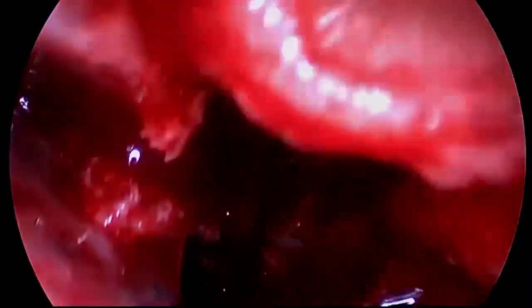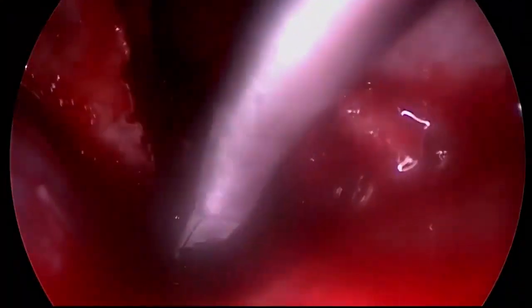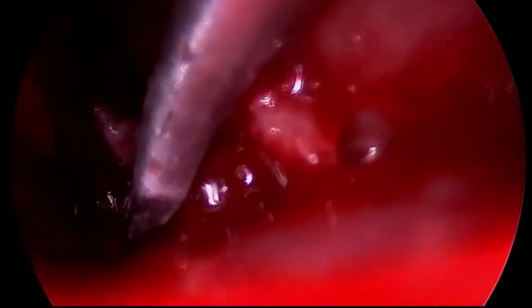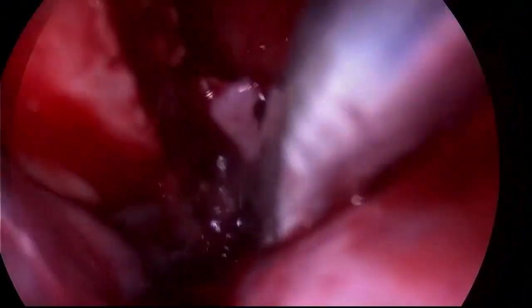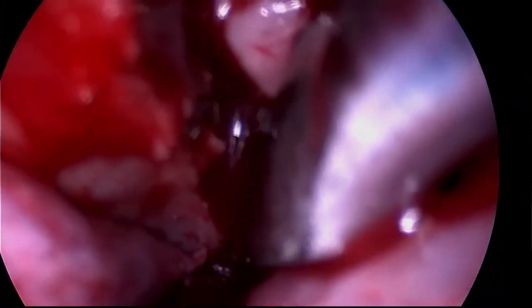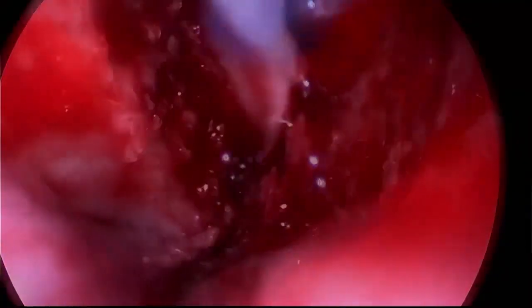Now we see that the osteotomy has been completely done and the nasofrontal suture has been reached. In order to make sure that there is complete release of both frontal bones, an osteotome is used to free the nasofrontal suture as demonstrated here. This does create a small amount of bleeding at the nasofrontal suture, which is then easily controlled with suction electrocautery.